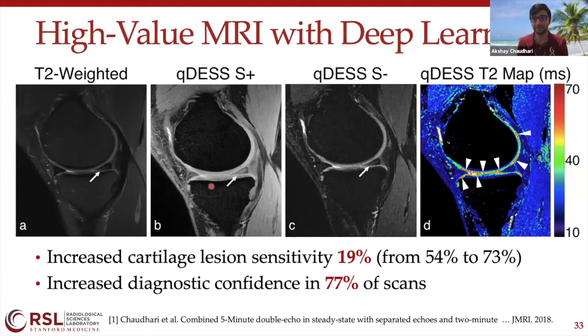And I think this goes back to the point of why we need multiple different contrasts clinically to begin with, because each contrast provides a slightly different glimpse into the structure of the joint, and each contrast has different pros and cons. And with qDESS, we're simultaneously able to generate these different contrasts that we can use for morphometric analysis, as well as a clinical analysis of injuries. So hopefully that answers the question.